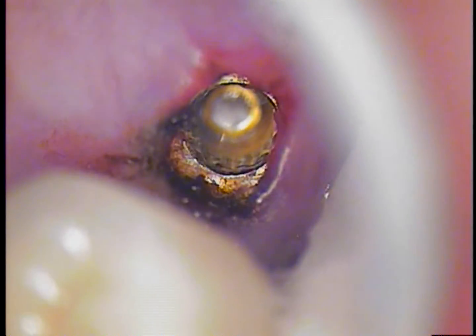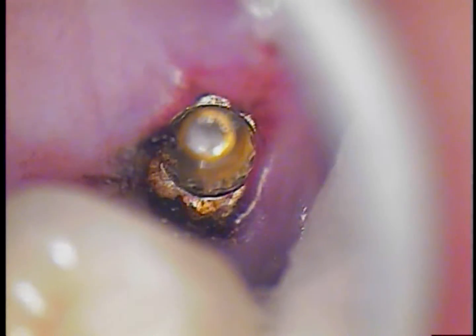So good news for the patient. The next step is to get it completely out, so we are going to continue to rotate our screw fragment.